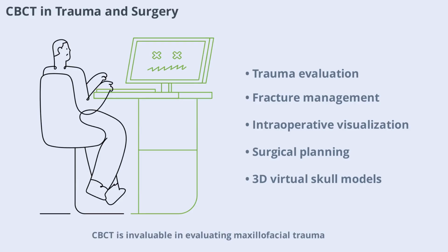CBCT is invaluable in evaluating maxillofacial trauma, especially for managing midfacial and orbital fractures. It allows for intraoperative visualization of bones and navigation during procedures involving gunshot wounds. CBCT is also used to plan orthognathic and facial surgeries, providing detailed visualization of dental surfaces and interocclusal relationships to augment 3D virtual skull models.